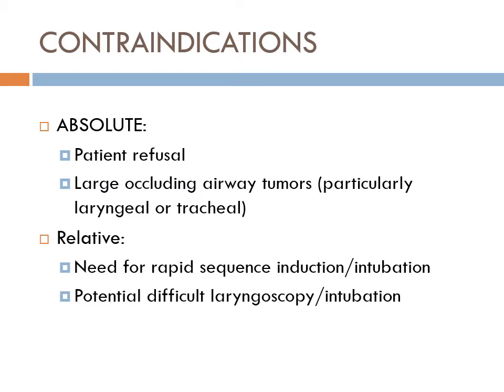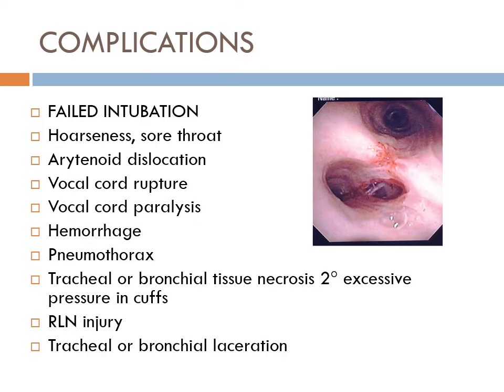You pretty much put the tube in so that the tip goes in right here. Right now it's acting like a single lumen tube, and you could theoretically ventilate here because the cuff will still be low enough, and the tube goes to the left, right, because it's a double lumen tube. But here's your other cuff. You can ventilate them like you would normally with a single lumen tube. It's just that the process of putting that in can cause a significant amount of trauma for someone who has a distorted airway. And a distorted airway could have tracheal deviation too, right?